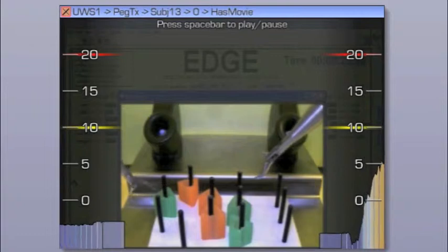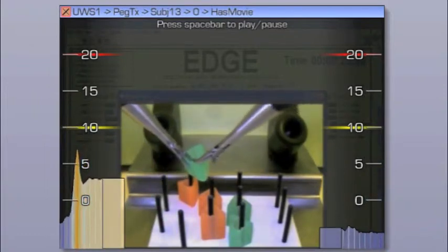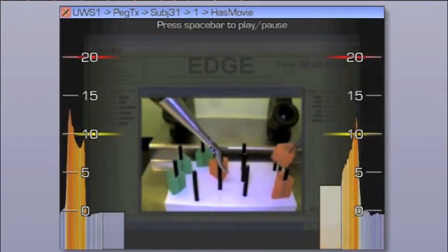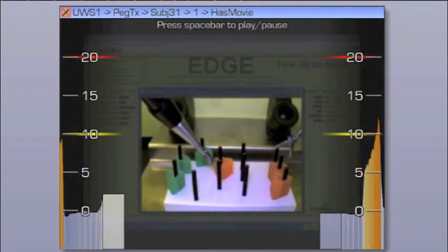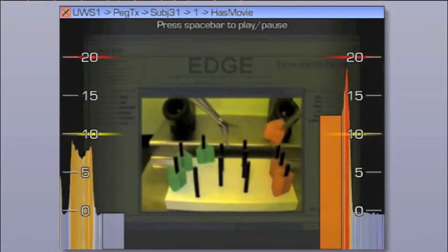Video visualizations are augmented with graphs showing the forces applied by each hand. Without visualizations like these, it is nearly impossible to understand surgeons' use of force by watching a surgery, except in the case when it is too late and excessive force has already damaged tissue.